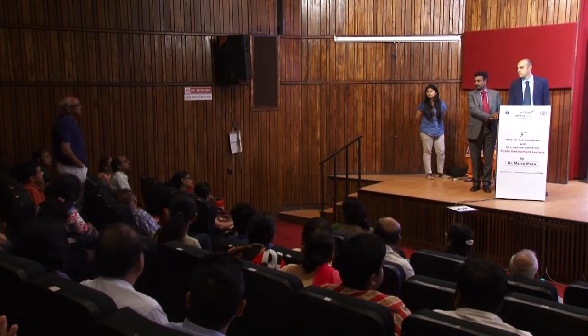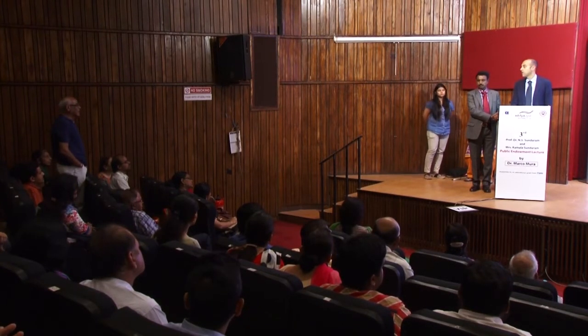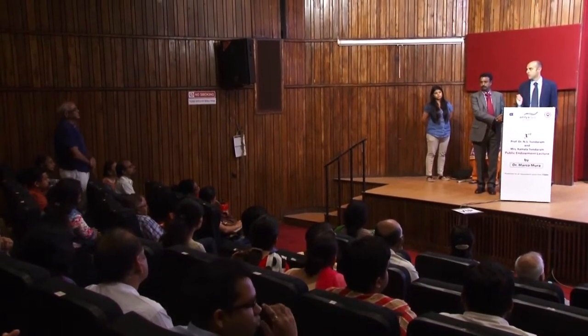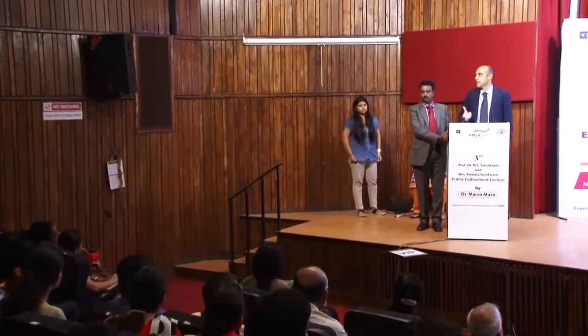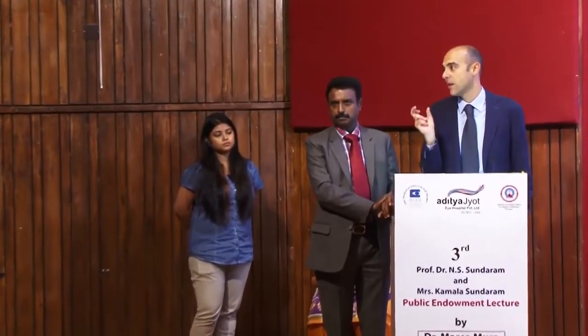Any chances for this surgery? I think for her at the moment it is not a good indication, because she still sees 25-30%, which is not bad. The normal vision we have, even if it's 25-30, will always be better than an artificial vision. Remember, artificial vision is generated by a computer and sent through little electrodes with limited resolution, so it will never be as good as what your daughter has now. It is meant for people who are blind, to get them back from blindness, back to the light. Thank you, sir.